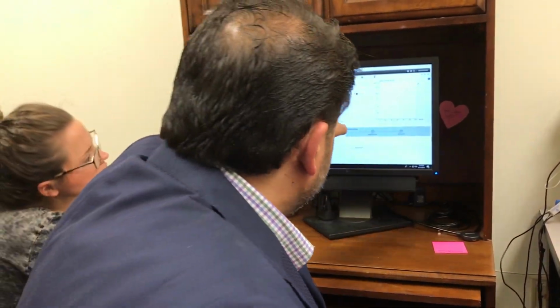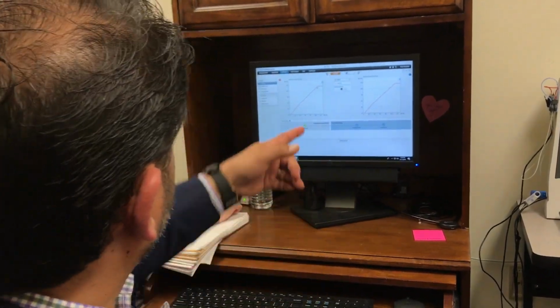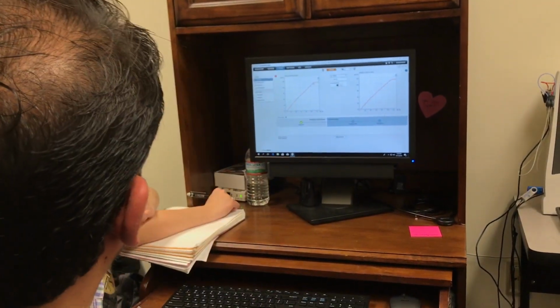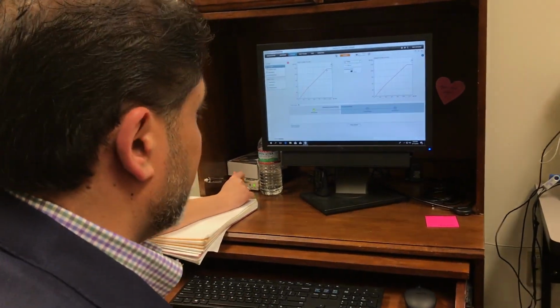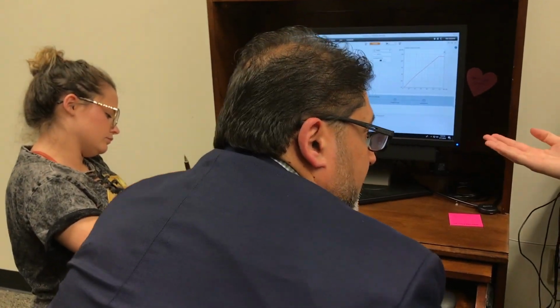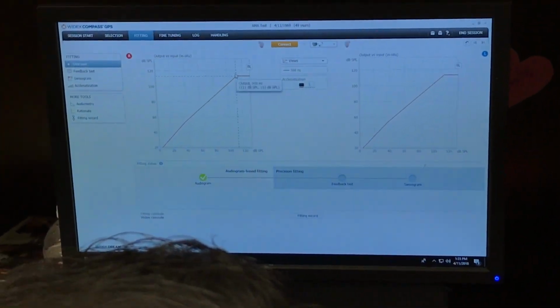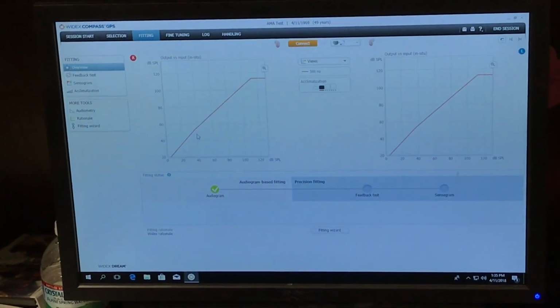Okay? The reason it limits it here, what happens if you go into an environment that has music? It's going to be loud. And so what they want to do is they want to cut it off before it reaches your uncomfortable level. Okay? So is that kind of like how we do with the knee point to kick compression in like 10 dB before the actual? Yep. So they do the same thing. This is like 10 dB below the UCL. Yep.